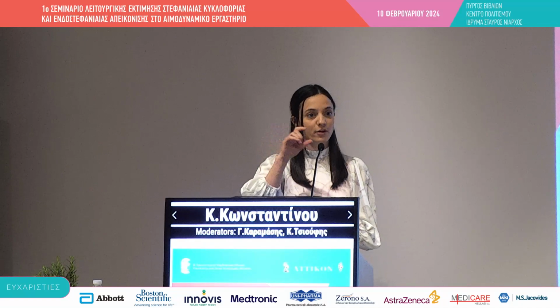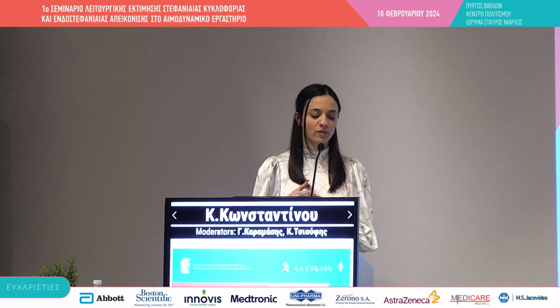So we diagnose endothelial-dependent dysfunction based on flow and how it changes with acetylcholine. If during acetylcholine administration, the patient gets chest pain and ECG changes and there is no epicardial spasm on the angiogram, then we tend to believe that they probably also have microvascular spasm.